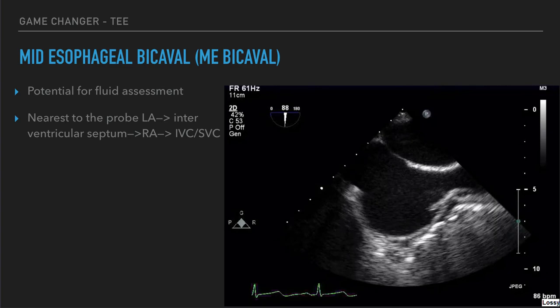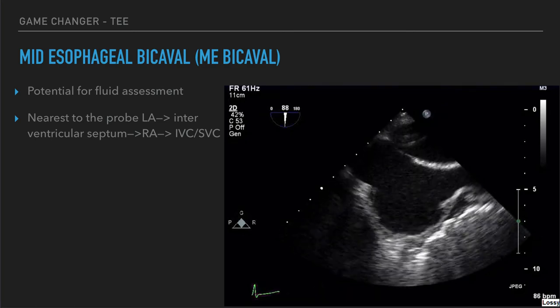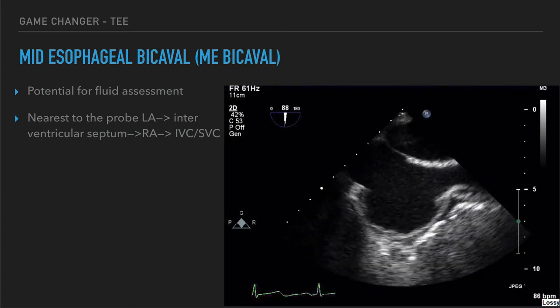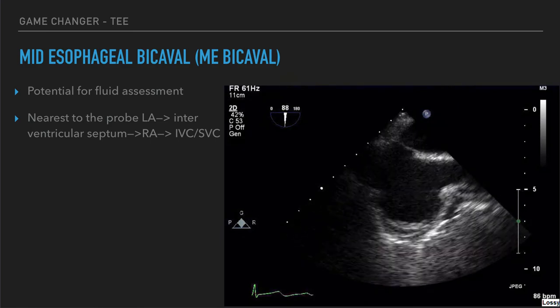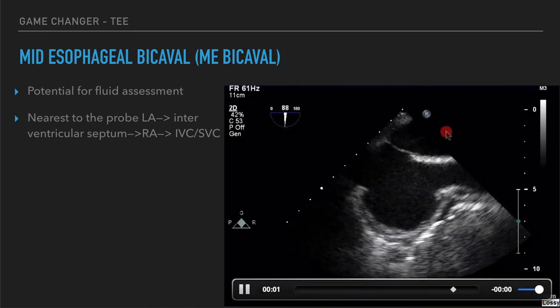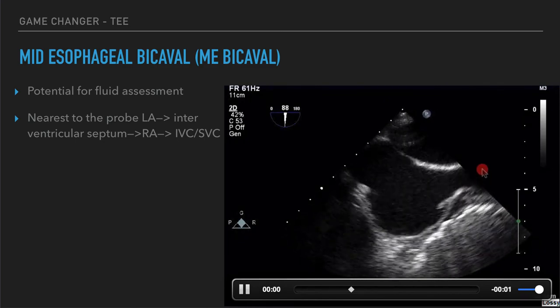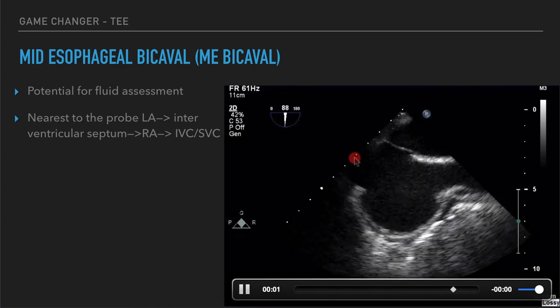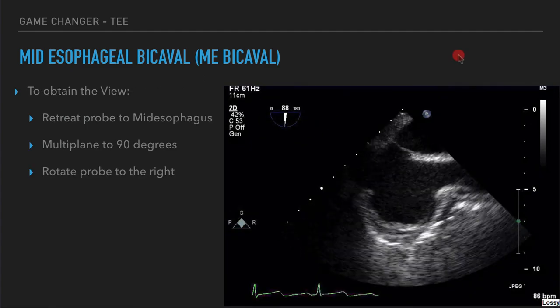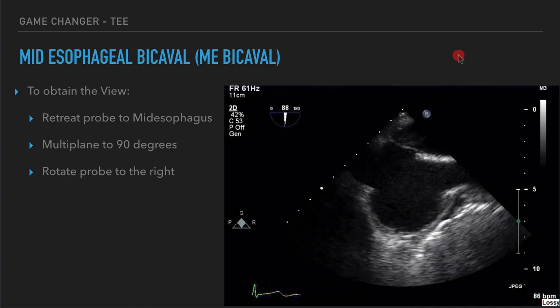There are two additional views. The mid-esophageal bicaval view has us back at the mid-esophageal window, and we're going to twist the probe to the patient's right to see these structures. This could be a potential fluid assessment window. You're seeing the left atrium closest to the probe, then the interatrial septum, then the right atrium with the superior vena cava on the right side of the screen and the inferior vena cava on the left side. The omniplane is right around 90 degrees for this view. Put the multiplane to about 90 degrees and rotate the probe to the right.